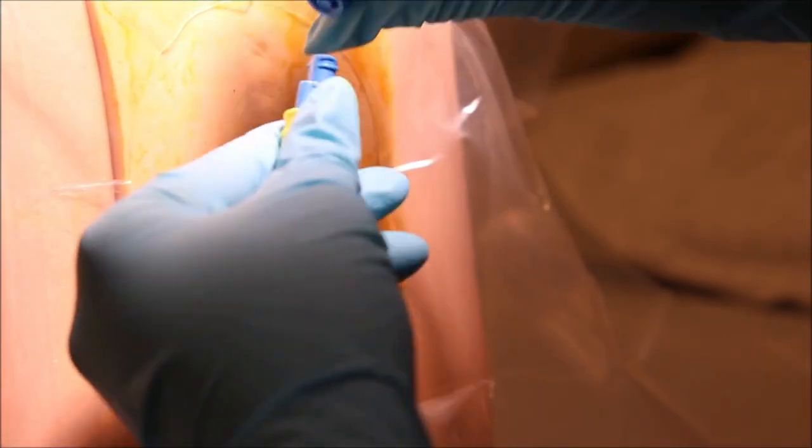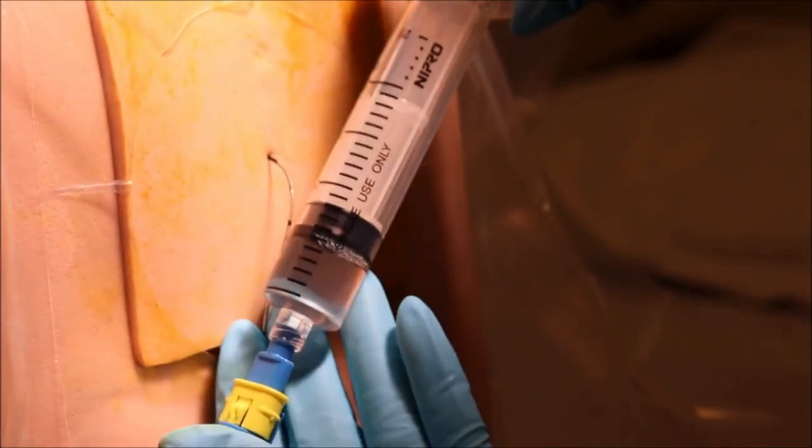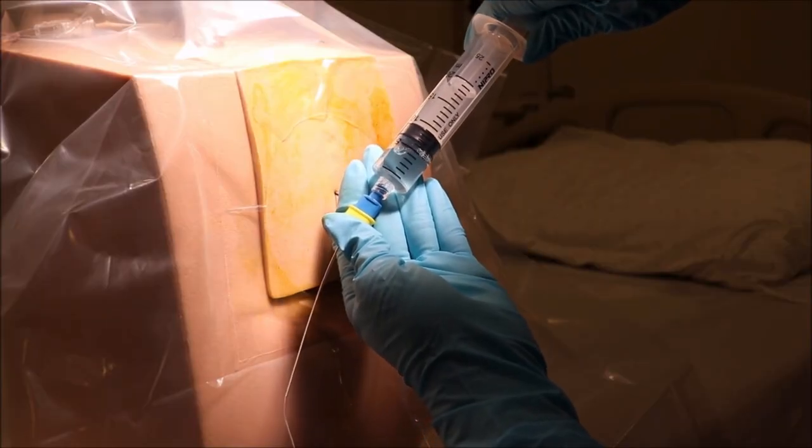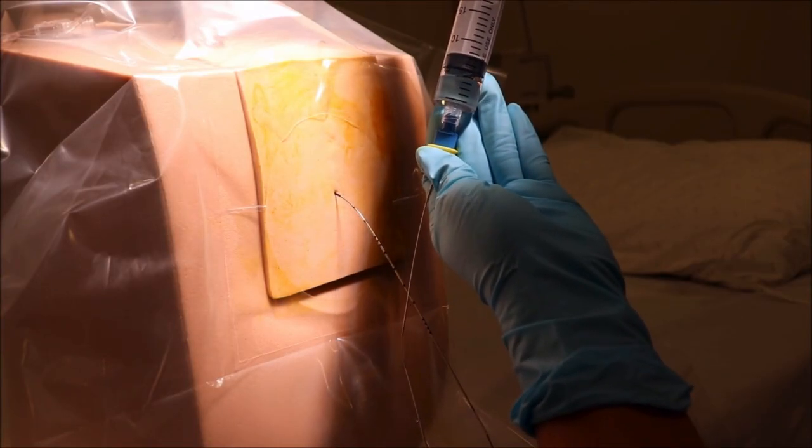Next step is the test dose. I will make a note of the patient's heart rate and blood pressure and withdraw on the syringe for negative aspiration confirmation, and inject 3 cc's. After giving the test dose, if nothing happens, the epidural is in correct place.